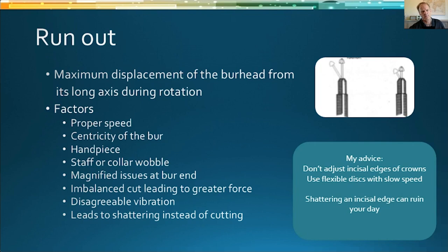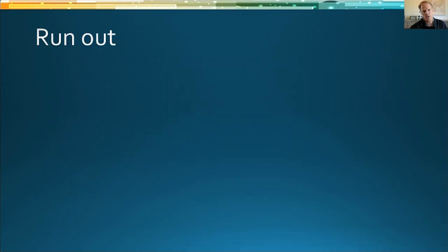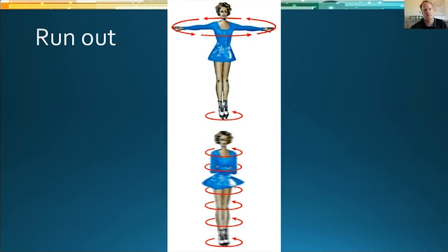So this was posted, it's kind of interesting: the burr head diameter, the bigger the burr head or the length, the lower the recommended working speeds. The concept being the more concentric you are, the more centered, the less wobble. Professional ice skaters know all about that.